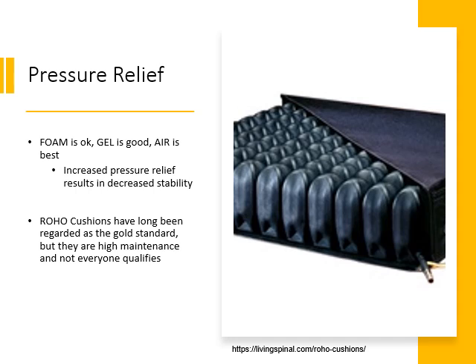Different kinds of cushions are used for pressure relief. There are high density foams or memory foams. Gel is good. Air is considered the best, but it's not really the best. It's a little bit finicky. Basically, these are different cells in a seat cushion, and you pump it full of air.